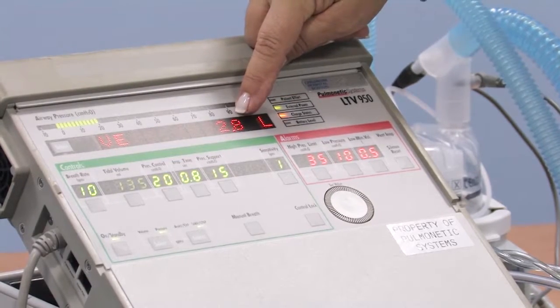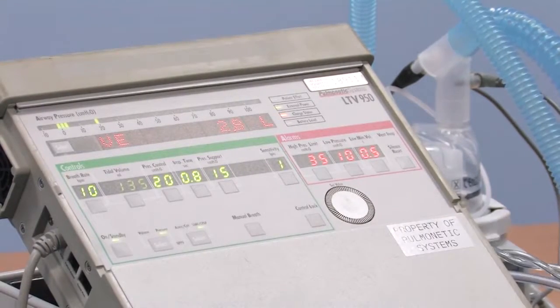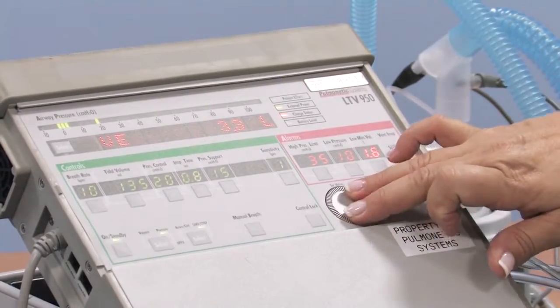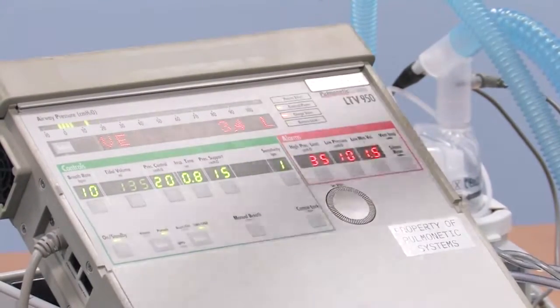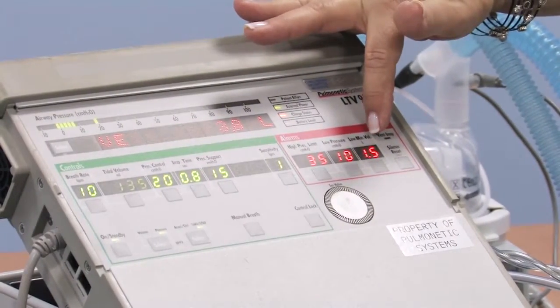If our patient is 3.1 liters, that's the amount of air that they're using in a given period of time, awake or asleep, whatever it is, we set the alarm at half that. So I'm going to set the alarm at 1.5 liters. So 3.1 is what your child's exhibiting that they're using right now, based on how many breaths they take and how big they are. And I set the alarm at 1.5.